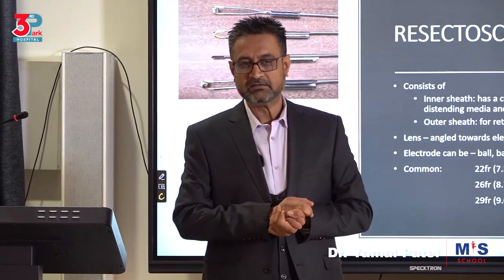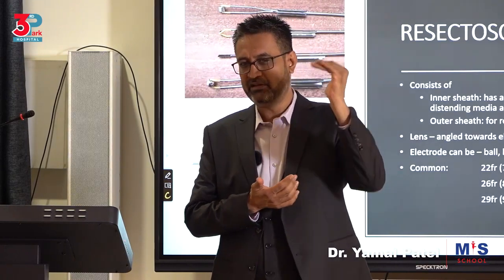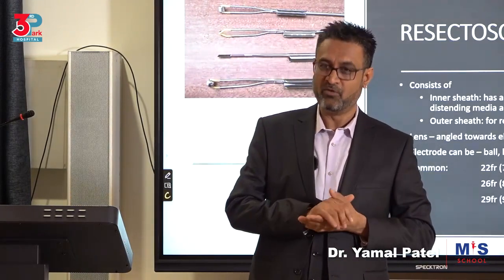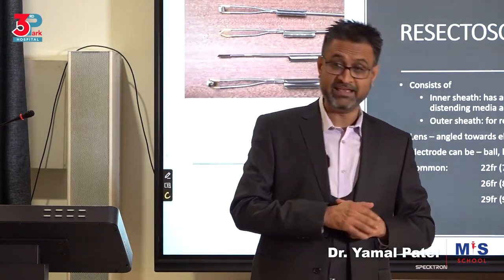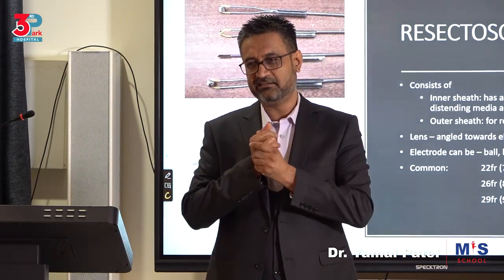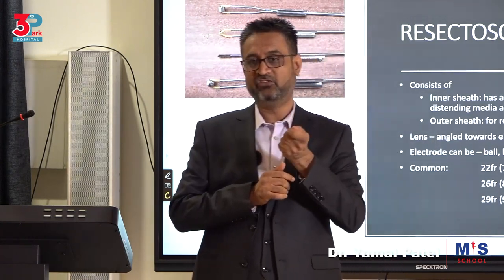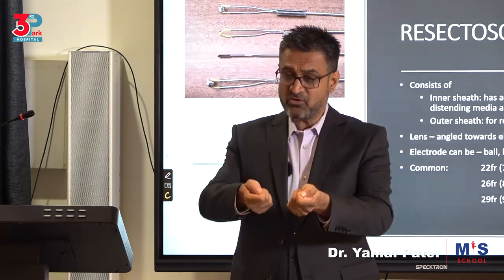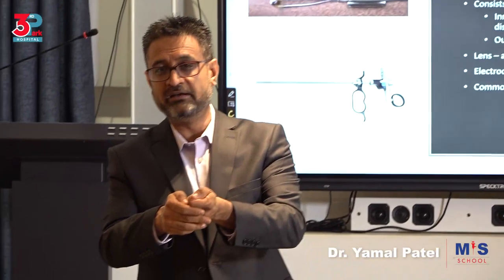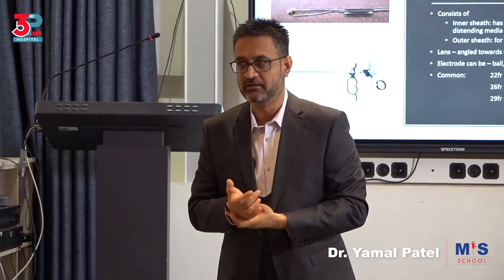In the past, we used to use monopolar resection with non-electrolytic solutions, which could be either hypotonic, hypertonic, or isotonic, but non-electrolytic, because monopolar cannot work in electrolytic solutions. Nowadays, we use bipolar. So my question many times to the students is, if I'm doing hysteroscopy, we use saline, am I right? So a question: if I'm using saline and I use a monopolar resectoscope and I activate it by mistake inside the uterus of the patient, what will happen?